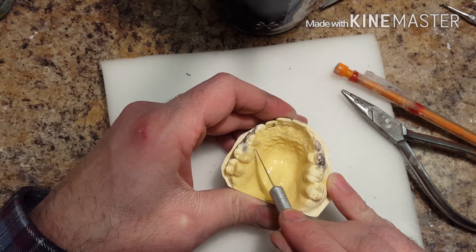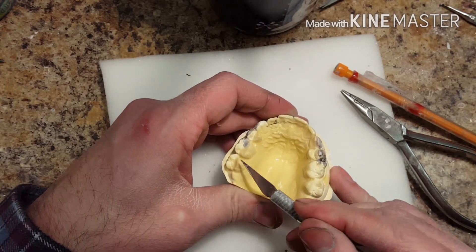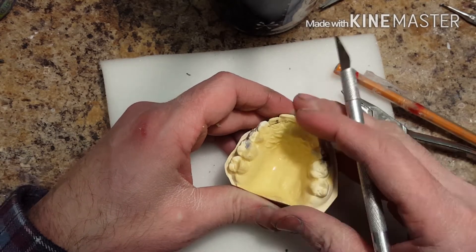Here I just found a little bleb in the model that I didn't like, so I might as well pick it off and make sure it's not going to interfere with the acrylic at all. Then I'm going to seat the final appliance.